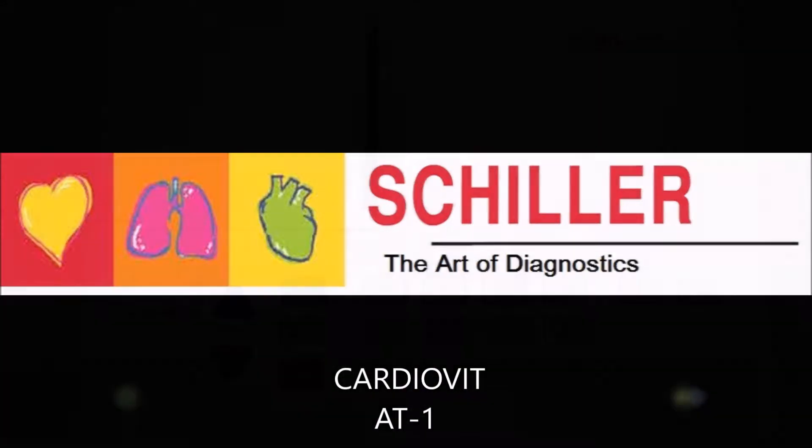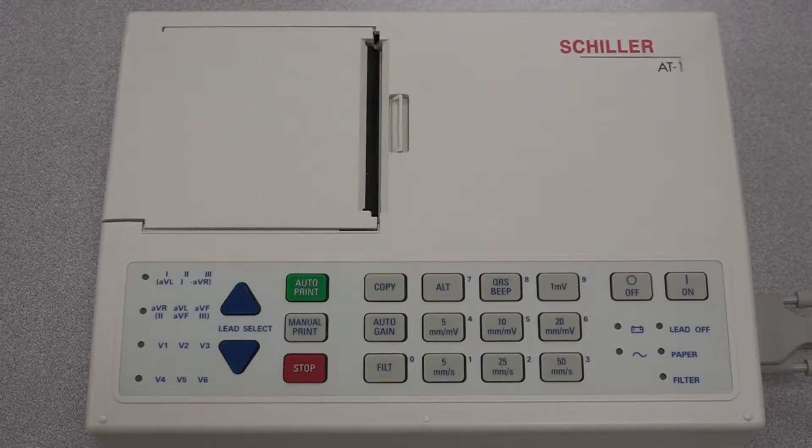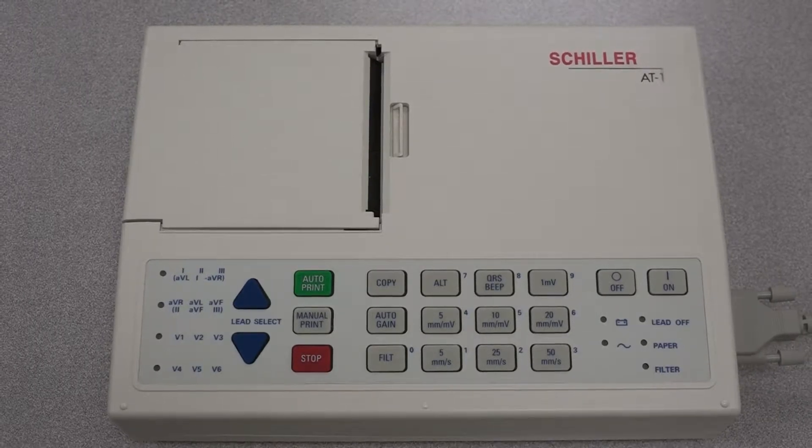The AT-1 from Schiller is an ECG that performs the 12-lead ECG analysis in a fast and precise manner. It's a small compact device with a simple mode of operation that makes it the perfect ECG for any type of setting.